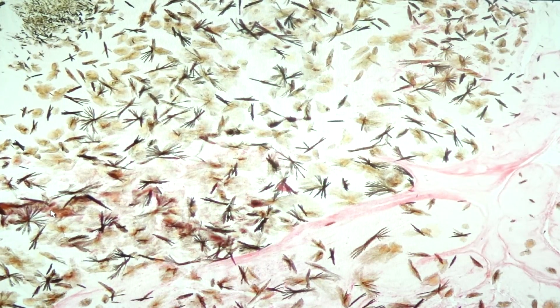Very easy. They look like dead gamo-gamo. So if you see gamo-gamo, monosodium urate crystals, this would be gouty arthritis.